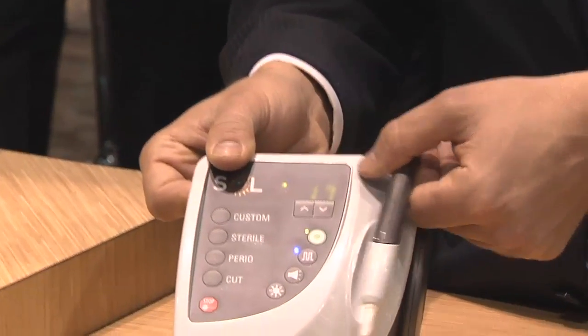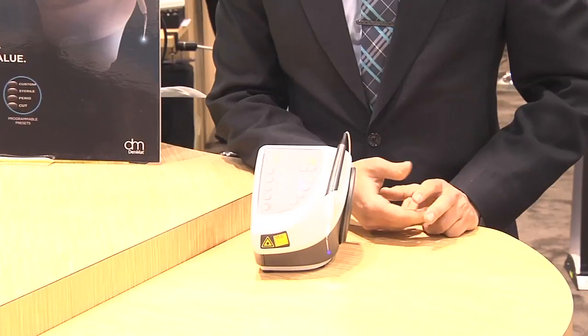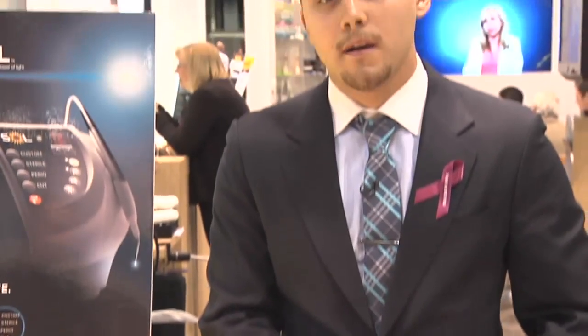It also has a convenient magnetic locking feature that keeps the handpiece neatly in place. This is very important when a clinician is working in multiple operatories, because it allows them the convenience and speed to see multiple patients.